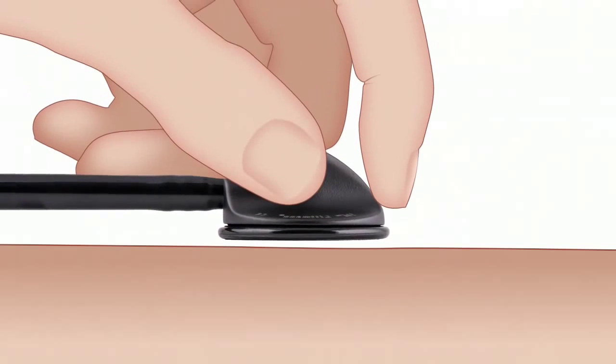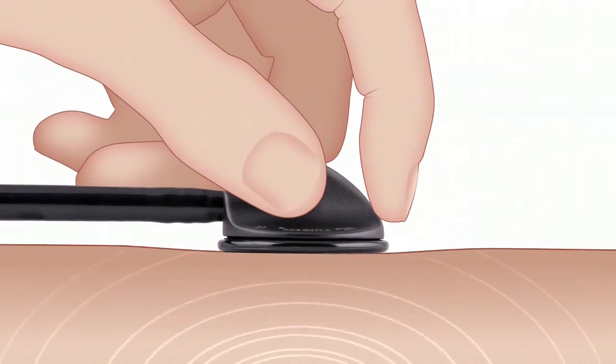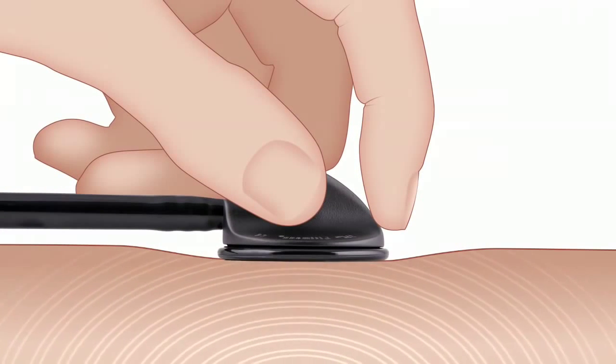When using a Littmann tunable diaphragm, use light pressure to emphasize low frequency sounds, and firm pressure to emphasize high frequency sounds.